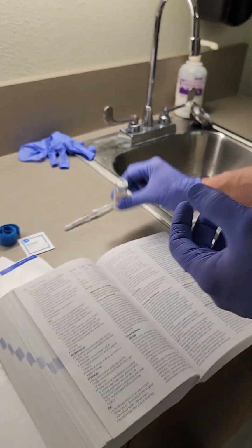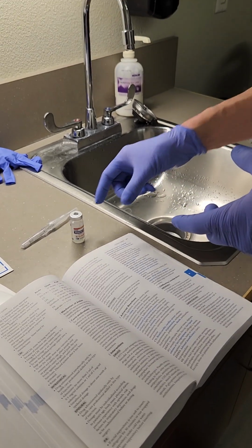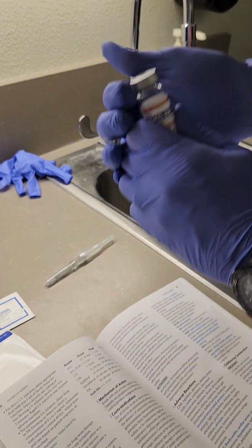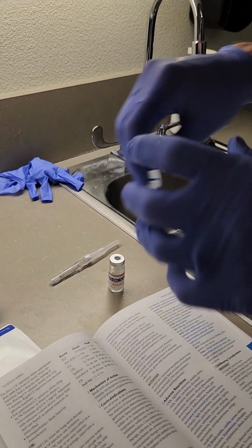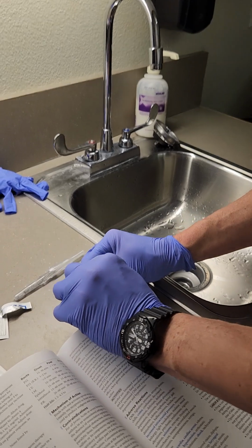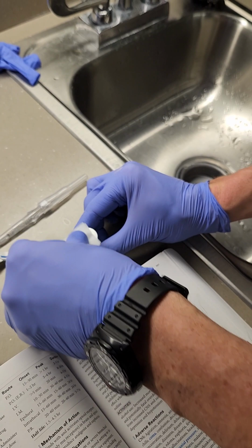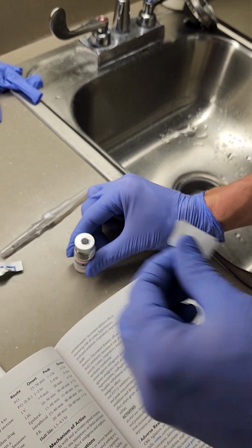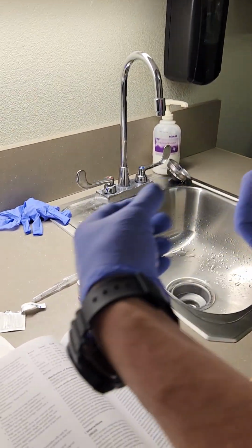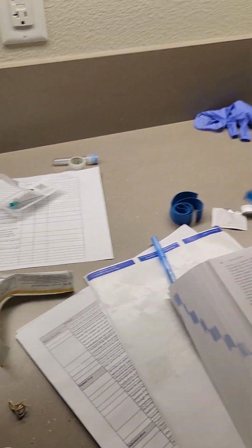All right, so I got this out and I verified that, and so now I'm going to clean this up. So I would pop the top off and clean this. Make sure that it is sterile. All right, and I'll give that time to dry, probably like 10 seconds or so. But that 10 seconds will go by while I am getting my needle.